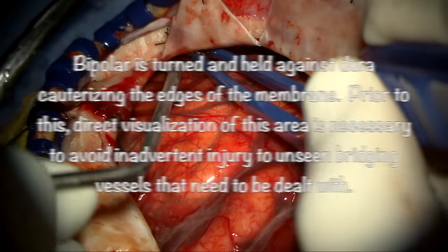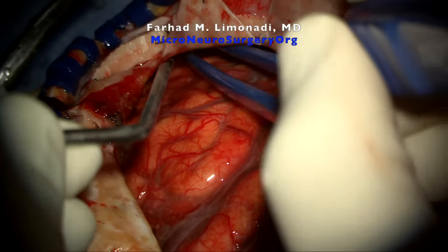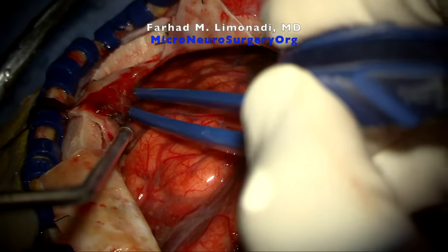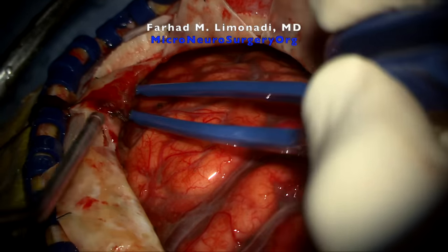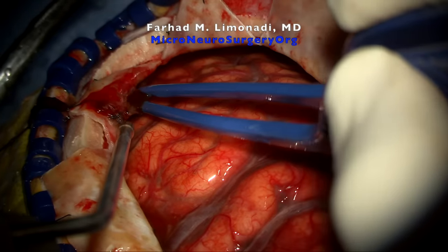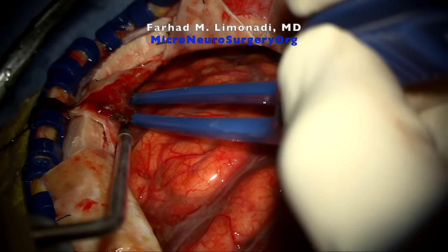Bipolar is turned and held against the dura, cauterizing the edges of the membrane. Prior to this, direct visualization of this area is necessary to avoid inadvertent injury to unseen bridging vessels that need to be dealt with. An angled view endoscope is quite useful here.